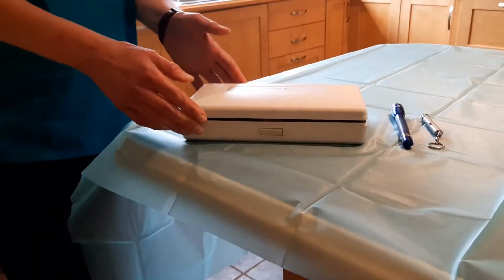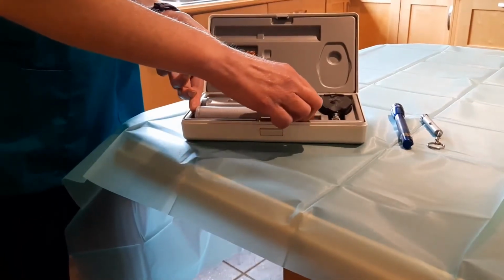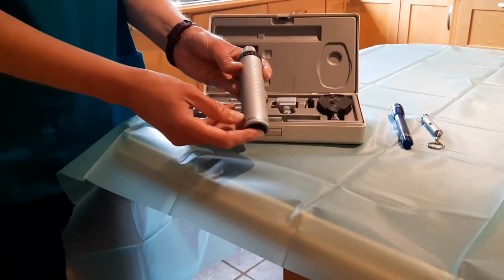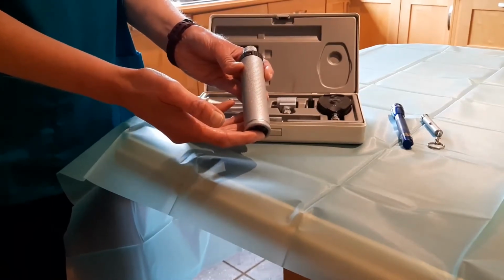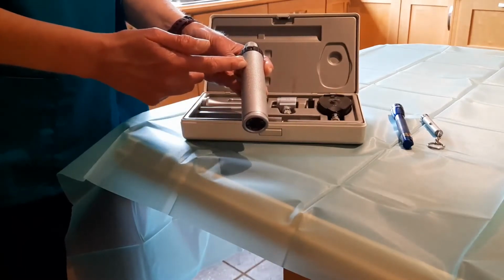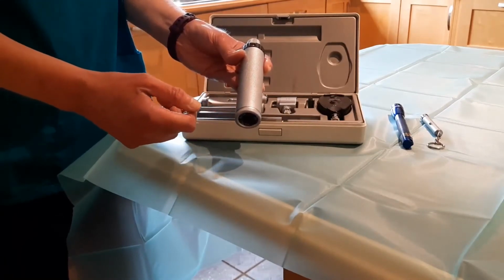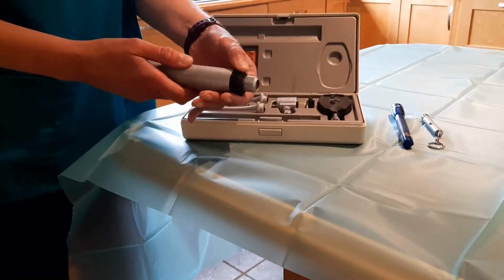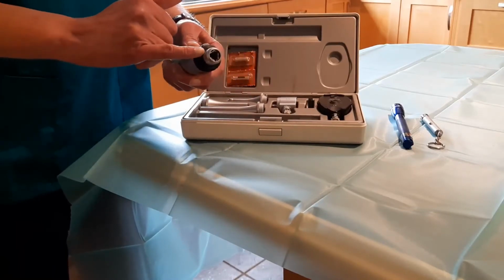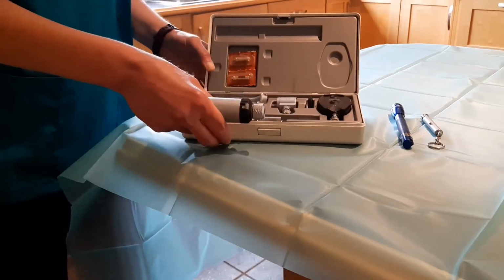This is a diagnostic set, and it comprises 2 instruments, an ophthalmoscope to examine the eye and an otoscope to examine the ear. This is the power base, and it's common to both instruments. In this case, it's a non-rechargeable model, so this is where the batteries are held. So if it's not working, you can unscrew the base here, change the batteries and see if that sorts it out. The on-off switch is here at the neck, and you just twist on and off. And the neck is where we insert either the ophthalmoscope or the otoscope head.